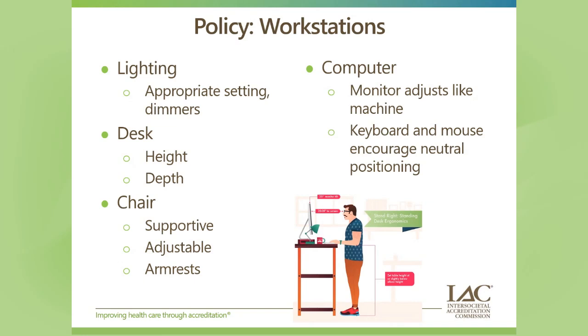Dimmers are very helpful. I know when I'm working with my sonographers, I always encourage them to look at how their readers are set up in their lighting environment, because that's really what the end goal is to set up my gains for optimal reading after the fact and what's on that PACS system. So just thinking about that, but also getting that break. And I know we all like to scan in the dark, but taking an opportunity to get out into those lighted areas is probably healthy for those eyes as well.